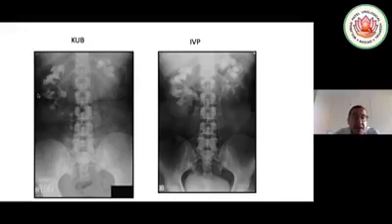My message is that I'm lucky enough that in Italy I have easier cases than this, first. Second, now apart from kidneys, this is a very, very tough case that is supposed to require at least 3 tracts, I would say. So my suggestion in this case is to do the 3 punctures in the beginning, then dilate only if you're going to need along the way. I would start with a puncture in the lower calyx, in the middle one, guide wire down in the ureter, and one in the upper calyx going in this direction.